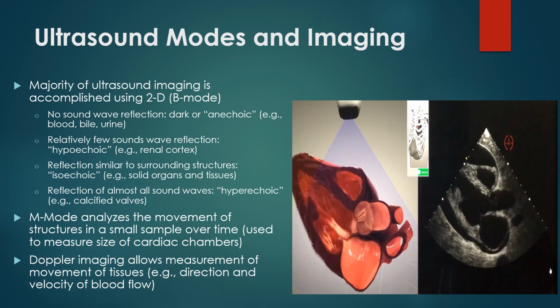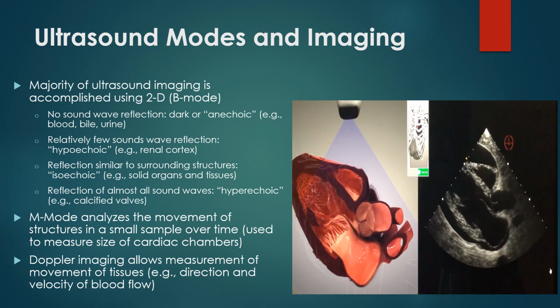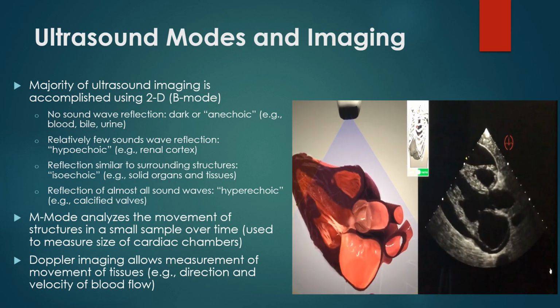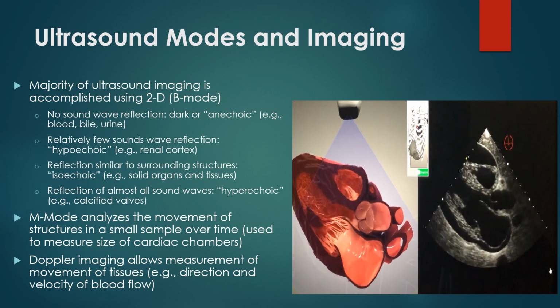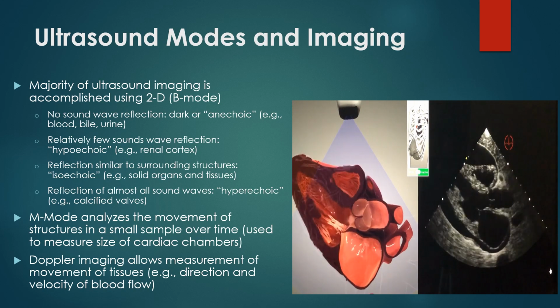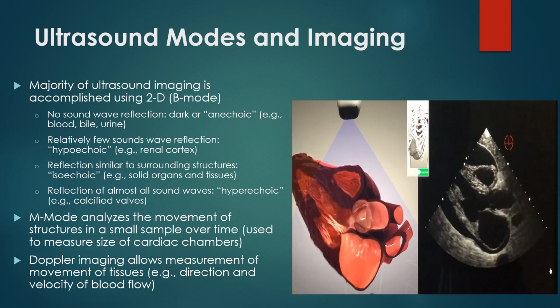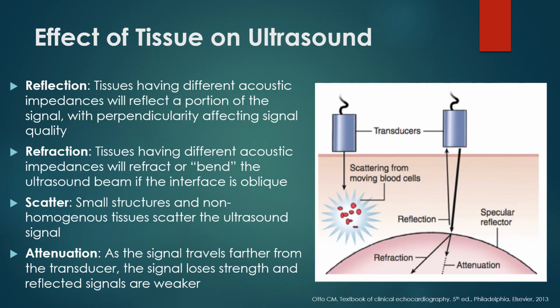This change in frequency, the amount of shift, correlates with the velocity and the direction of the particle motion, such that when you put Doppler imaging on, depending on the color, you get velocity, and depending on the color, the direction of the flow. Again, it's a lot more complicated than a single slide, but a more utilitarian approach is what I'd like to offer in this presentation.